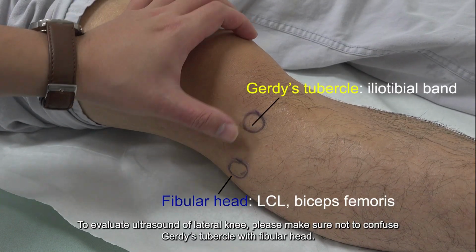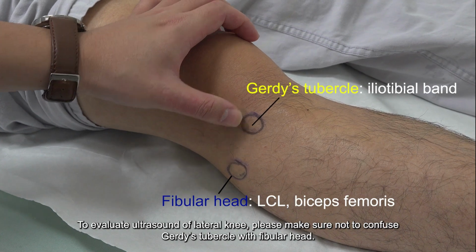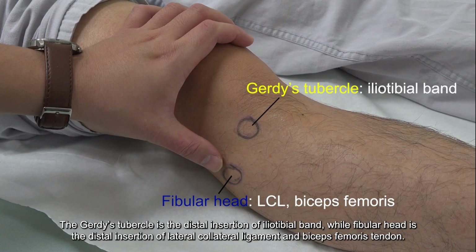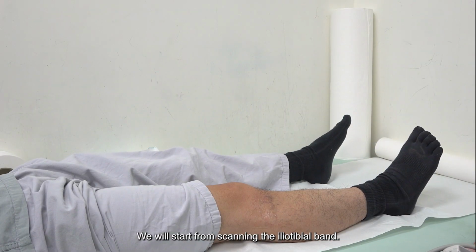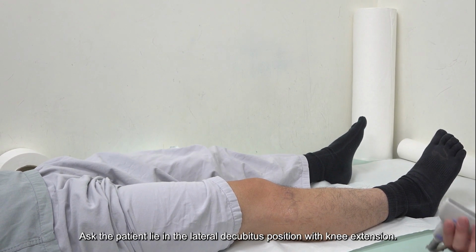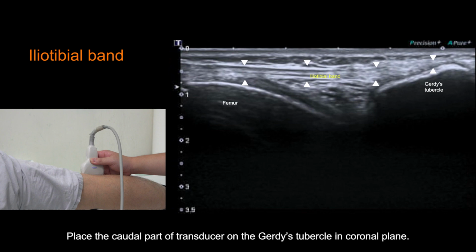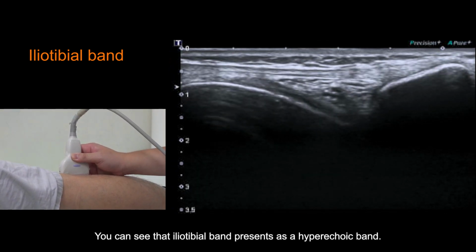To evaluate the lateral knee by ultrasound, please make sure not to confuse Gerdy's tubercle with the fibular head. Gerdy's tubercle is the distal insertion of the iliotibial band, while the fibular head is the distal insertion of the lateral collateral ligament and biceps femoris tendon. We will start by scanning the iliotibial band. Ask the patient to lie in the lateral decubitus position with knee extension. Place the caudal part of the transducer on Gerdy's tubercle in the coronal plane. You can see that the iliotibial band presents as a hyperechoic band.